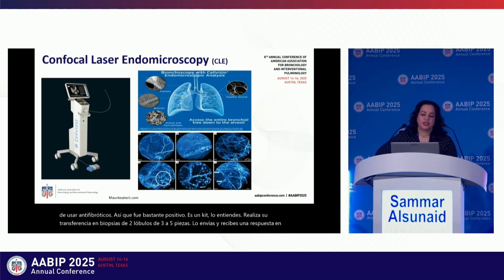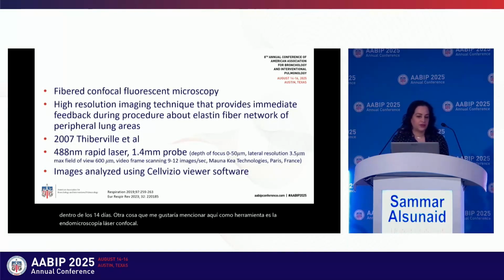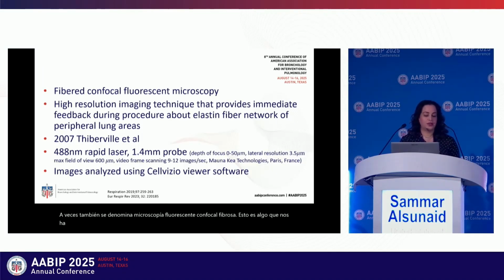Another thing that I would like to mention here as a tool is confocal laser endomicroscopy. It is sometimes also referred to as fibered confocal fluorescent microscopy. This is something that has moved on to us from our colleagues in GI. So it's high-resolution imaging that is providing immediate feedback during the time of your procedure.